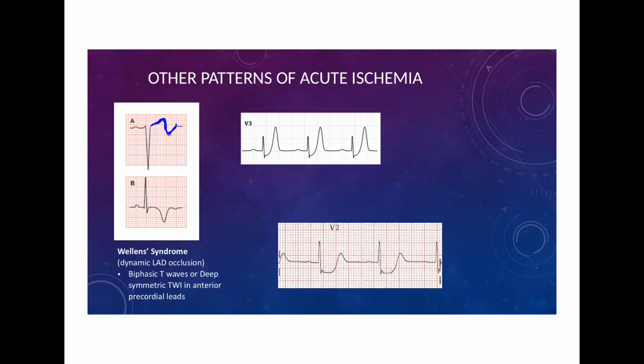This isn't indicative of 100% blockage of the LAD, but it usually indicates that there's dynamic changes going on. So there's the vessel being blocked, reopening again for a little bit, and then blocking off again. So you want to watch these patients very, very closely. If not, take them for left heart cath right away.